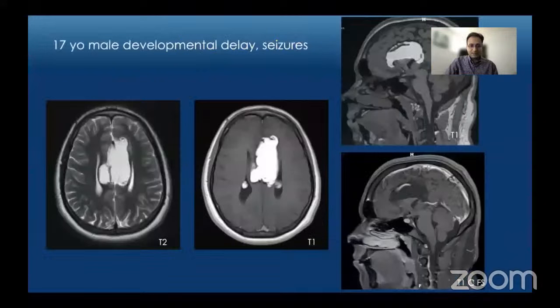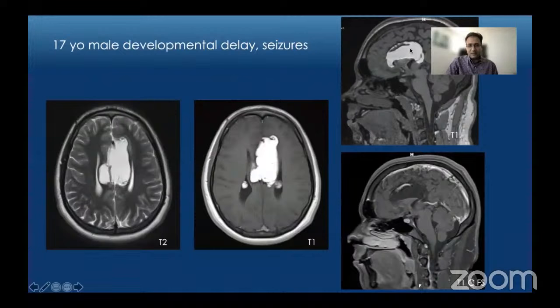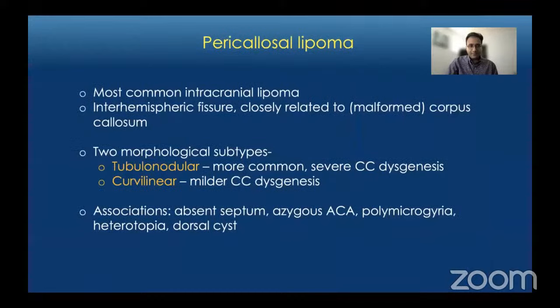This companion case is a 17-year-old male with developmental delay and seizures. On axial T2 and T1-weighted images we see a lobular hyperintense mass in the midline in the expected location of the corpus callosum, with parallel orientation of the lateral ventricles. On sagittal T1-weighted images we see a lobular T1 hyperintense mass in the region of the corpus callosum, which completely suppresses on fat-saturated sequences. There is an enhancing vessel through that region, suggesting a pericallosal lipoma with dysgenesis or absence of the corpus callosum.